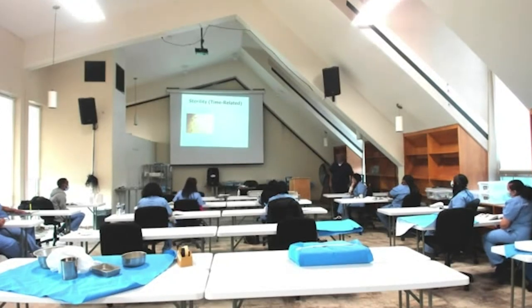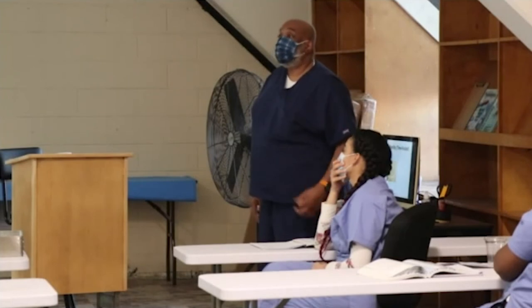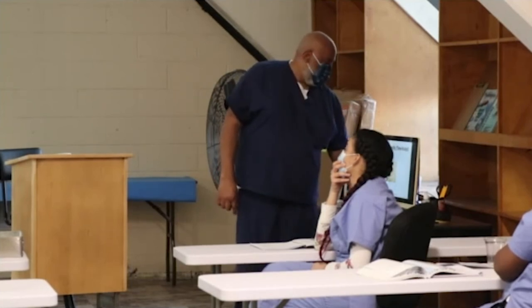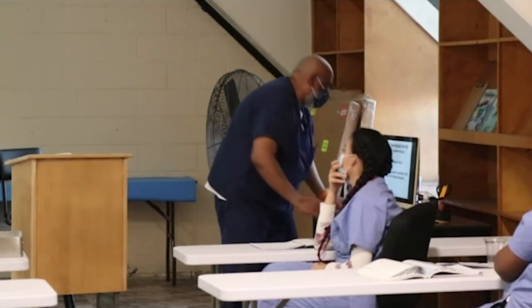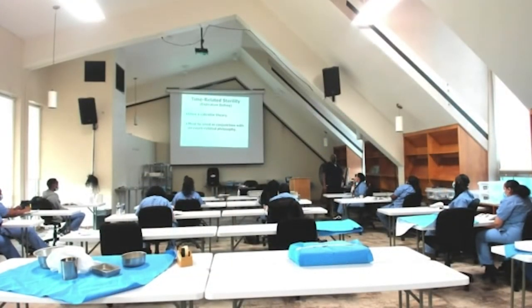Okay. Sterility, time related, and event related. Remember we looked at that a little bit? Time related, if you look at that calendar, is dated April the 15th. So if it's time related, we may say after it reaches this date, a year, then it's no longer good. This is time related. It has an expiration date of how long we're saying that package is validated to be sterile. After it reaches that expiration date, Shanika will go ahead and reprocess it, even though it's never been used.